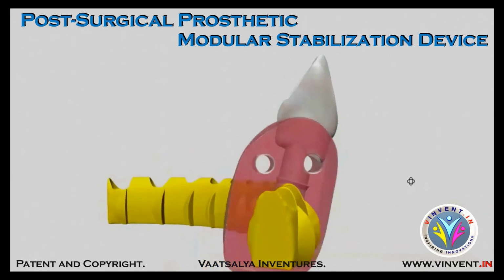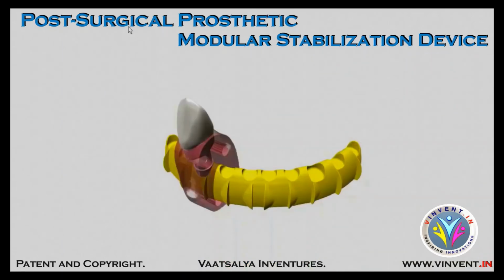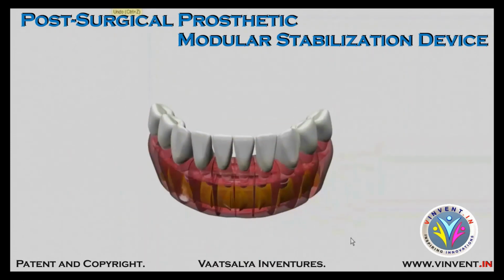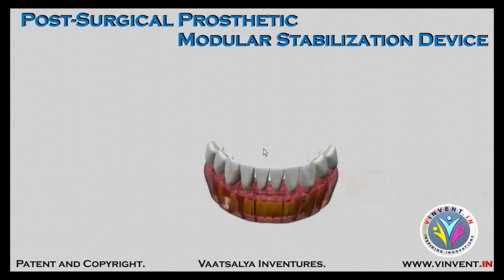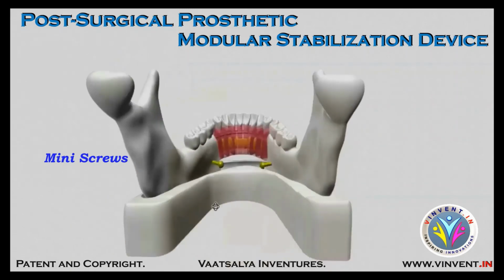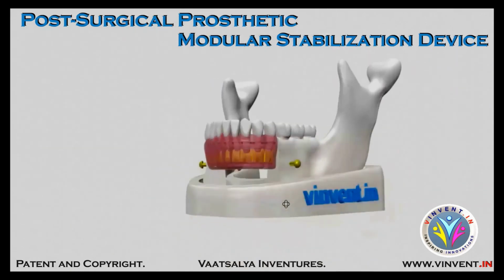The amount of soft tissue component present on the lingual space between tooth component and the retention wire will act as a cushion, and the retention wire will prevent lingual tipping of tooth component. Once the complete assembly is ready, retention wires can be anchored to the remaining halves of the mandible by use of mini screws and interdental spaces of remaining teeth.